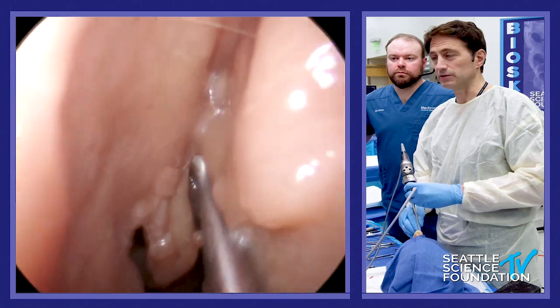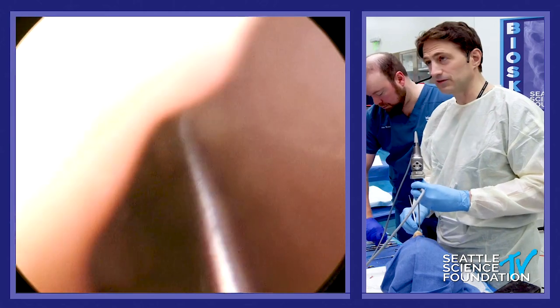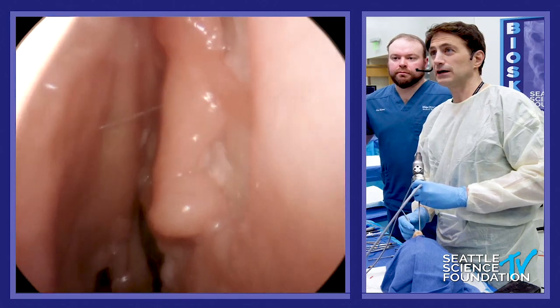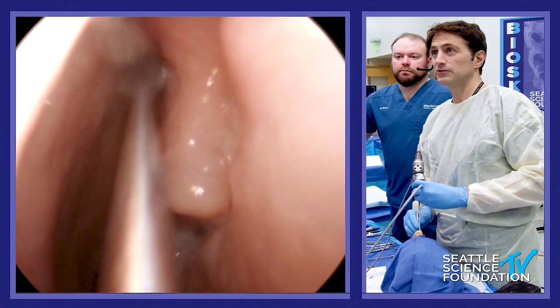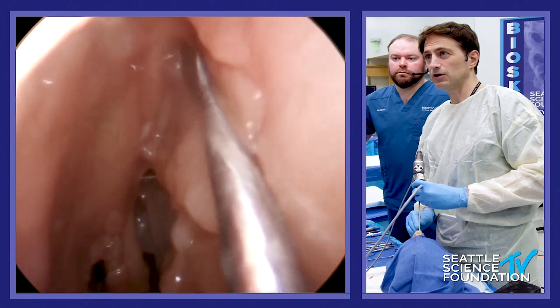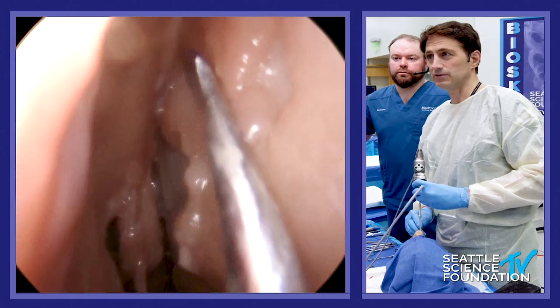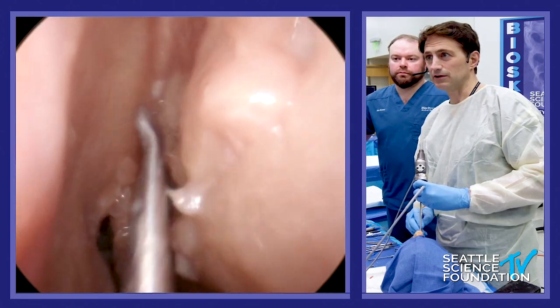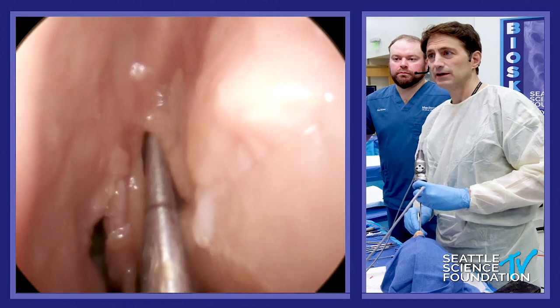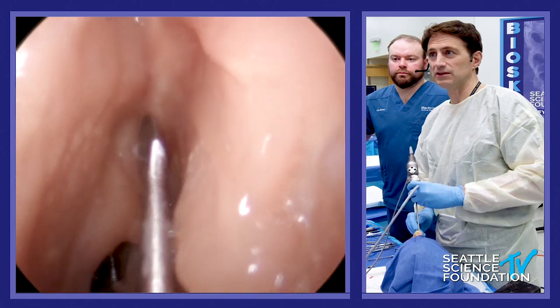Okay, so this is where it was harvested right here. The way to elevate this — I've been doing this a long time and this is hard. The kind of old-school way that I originally described this back in 2009-2010 was actually just elevating a flap here, harvesting this as a free graft, and then putting free grafts up at the end. That technique has been published extensively. There's randomized controlled trial data on it now showing that if you cover the exposed bone it's better than leaving it exposed. This is just a more advanced technique.